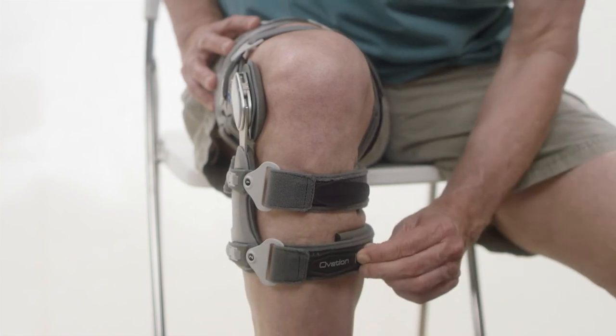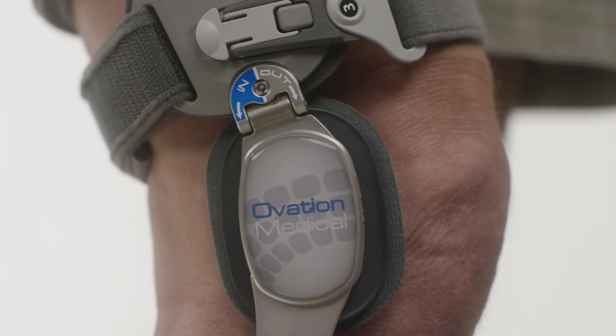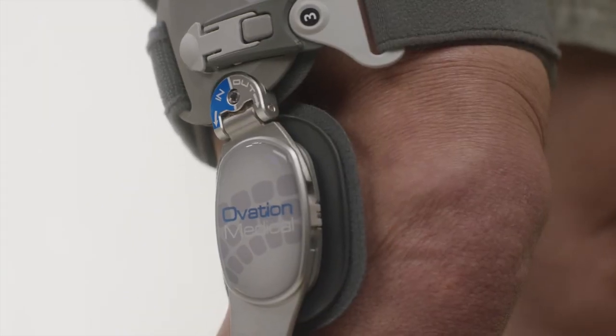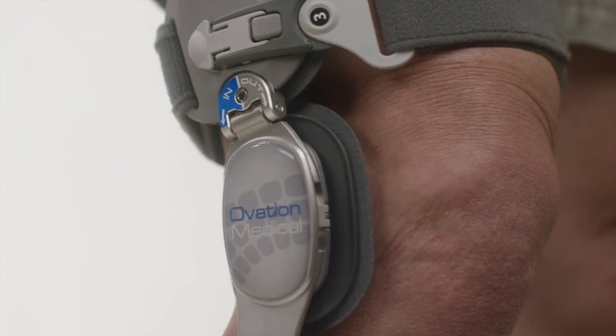If the patient experiences pain in the knee, joint, or leg, turn the hinge adjustment back slightly. If more relief is required, turn the hinge adjustment no more than one-fourth of a turn, as directed by your provider.